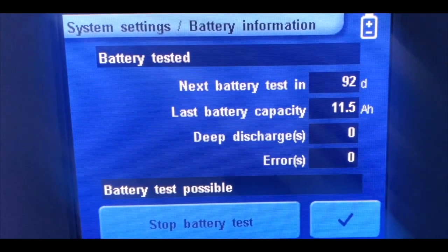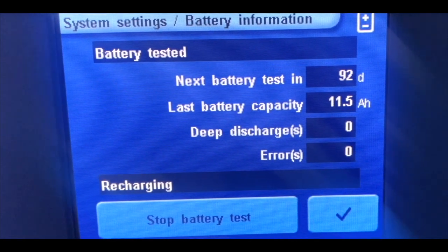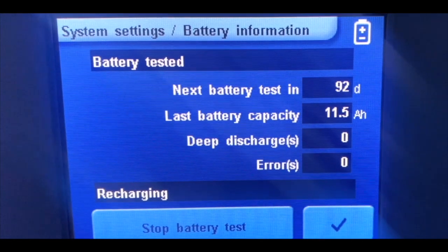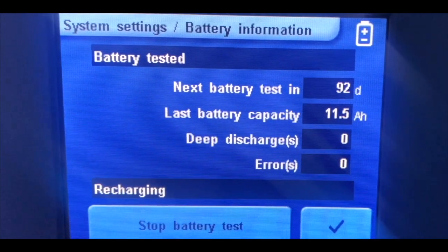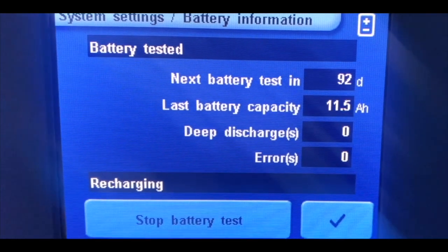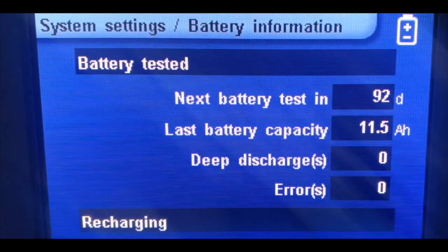Once it's done you will get a notification on the display that battery test is completed. Then you have to press on stop battery test. Your heart-lung machine is ready for surgery. After completing this entire procedure you can remove the external battery and close the cover of the heart-lung machine. This is the battery test procedure.